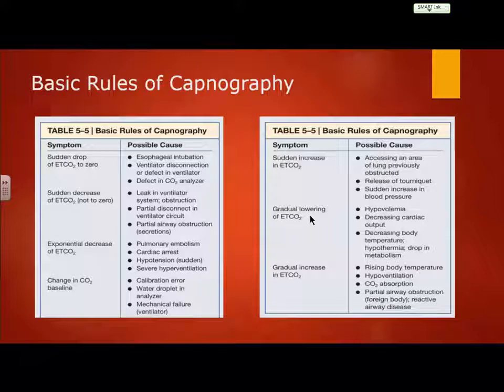Now, on the flip side, what if you get a sudden increase in end-tidal CO2? Well, I'll tell you this. If you're working a cardiac arrest patient and you start seeing an increase, and it would probably be more of a gradual increase, that's a good sign. That's a good sign, right? Because when we're working a cardiac arrest patient, doing good compressions, bagging, we're still not going to expect to see 35 to 45. Not going to happen, all right?